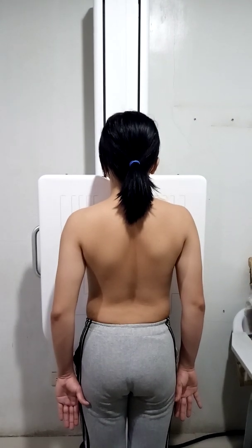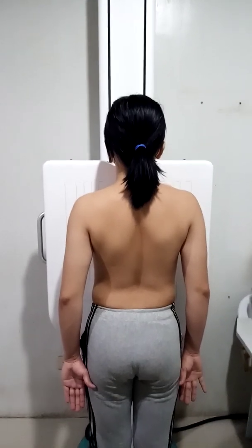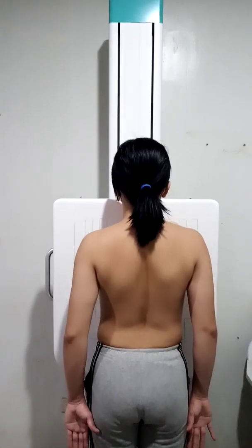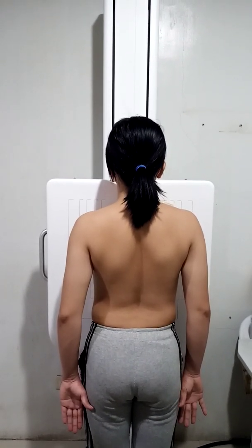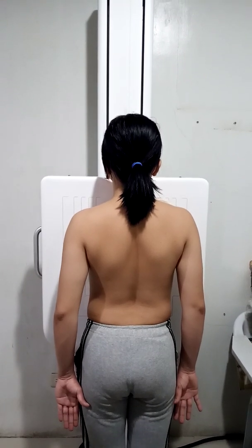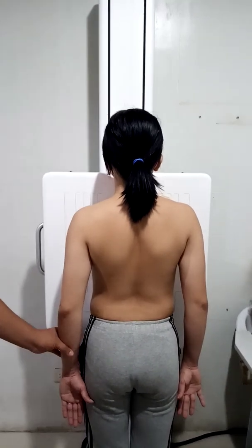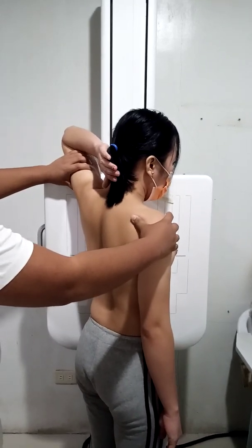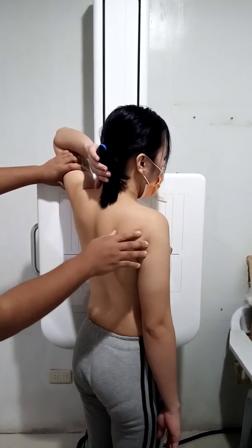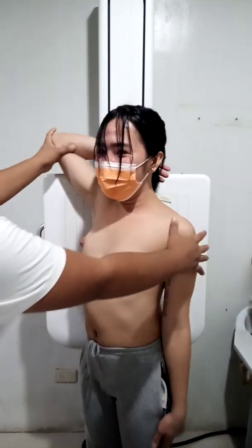Then the next position is the right posterior oblique position. So in patient positioning, the patient must be positioned either upright or supine. Then in part positioning, rotate the patient's body 45 degrees with the affected side toward the image receptor. Since we're going to do the right posterior, this is the right posterior oblique position.